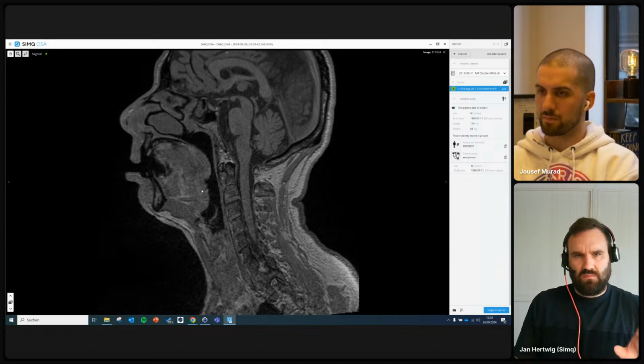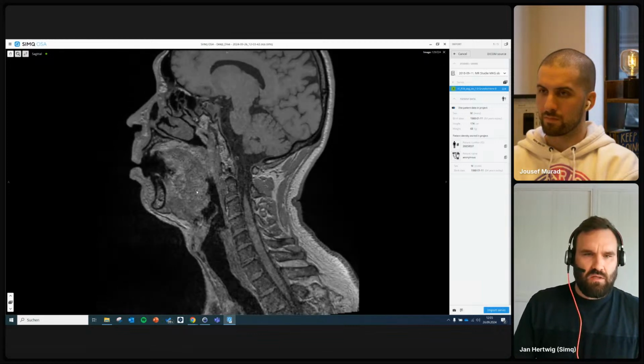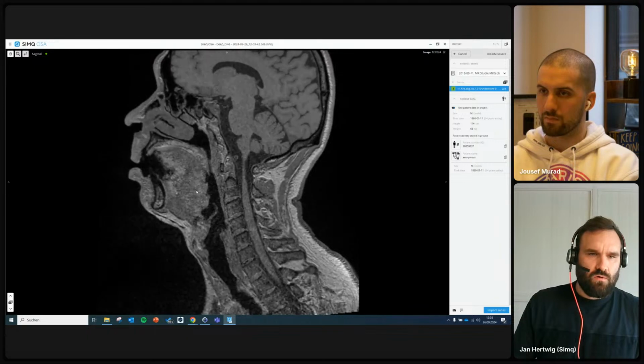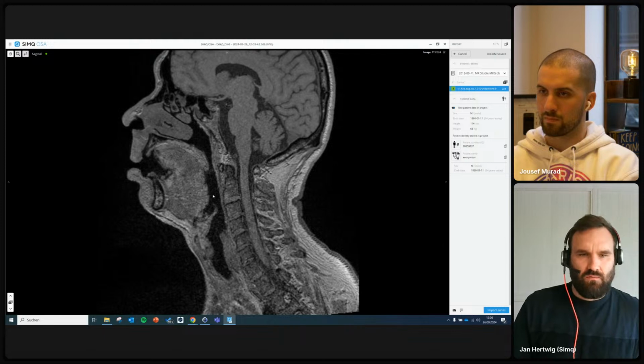It is possible, but it's very grainy and you don't know what you get out of it. So you need some mechanism to make a repeatable and good model for this one unique patient, and for that we use, of course, ML.